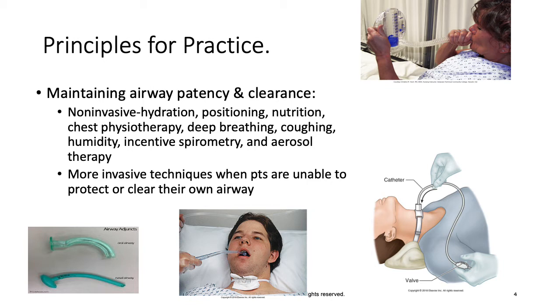They can also use vibration tools that will provide a vibration over the chest to loosen secretions as well. Everyone learned about coughing and teaching our patients to cough and deep breathe during probably first semester. Deep breathing is important to make sure the alveoli stay open, and coughing to mobilize secretions, of course.